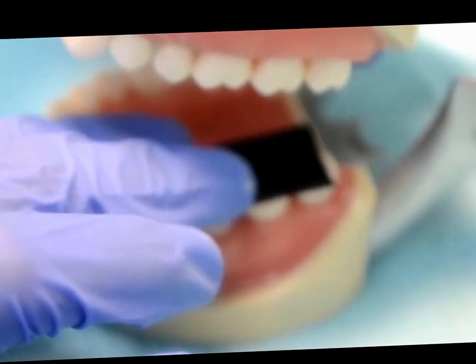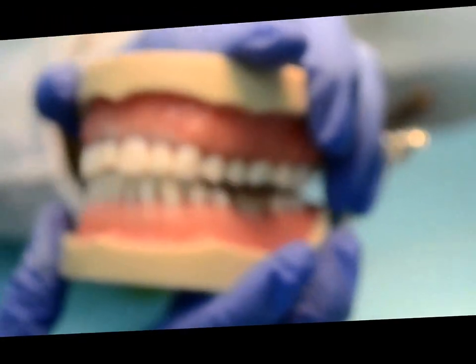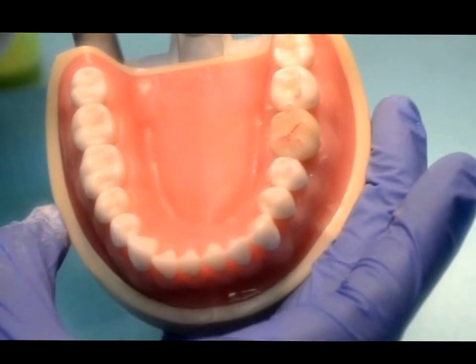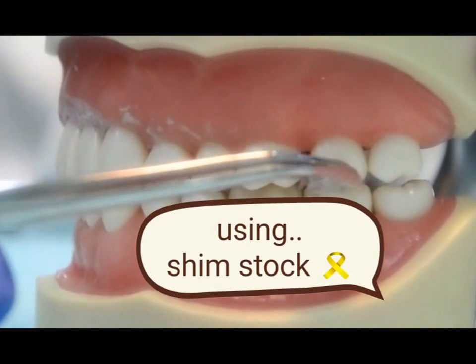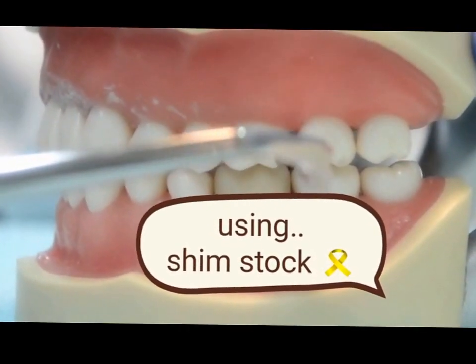You have to hold the bur in a proper way and remove the excess. You have to check the occlusion by using articulating paper. Check the high points of occlusion.